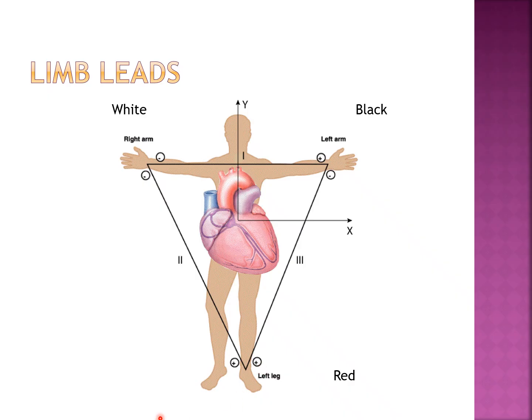Now why is that important? Well, it's important for understanding the direction that the electricity moves in. So if the electricity moves toward the positive pole, we like to say that we get an upward deflection.